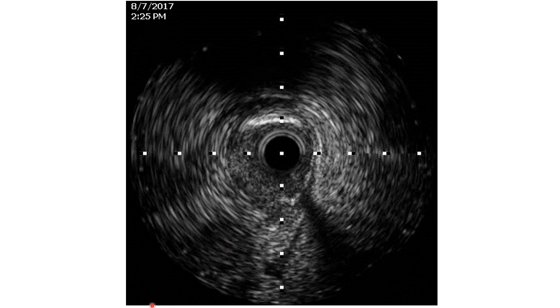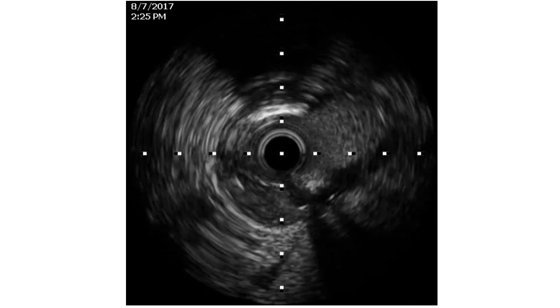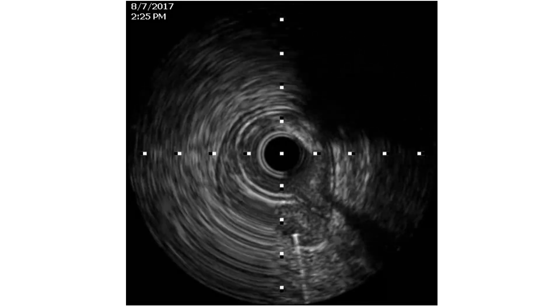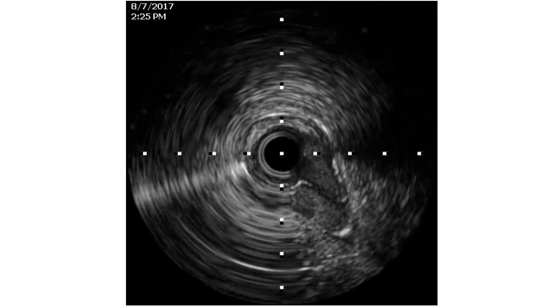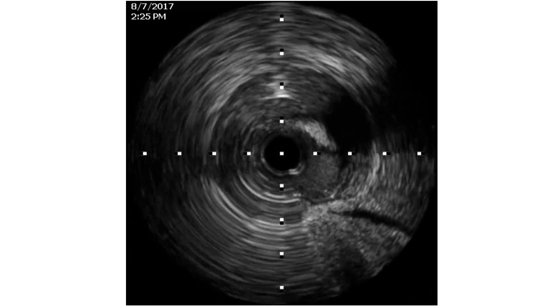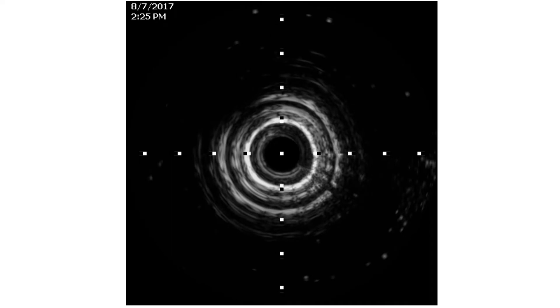Here we show the near-pullback of the IVUS catheter. This is the distal part. Here there is some hematoma extending at the distal or mid part, and we can see the wire is in the hematoma — extraluminal here. There is some artifact and then the extension of the hematoma is clear up to the ostium of the right coronary. So the dissection clearly started from the ostium of the right coronary artery.